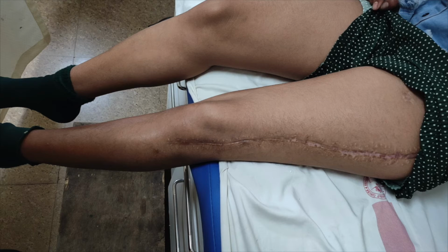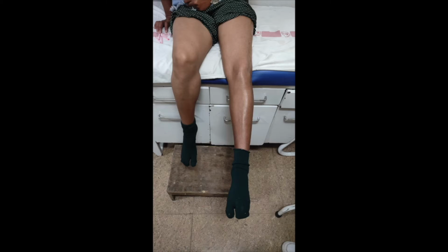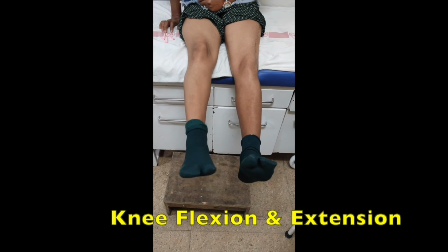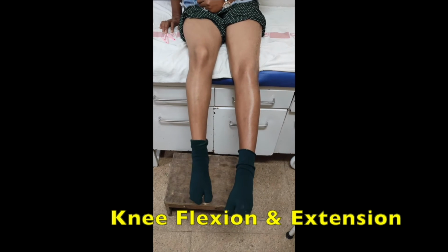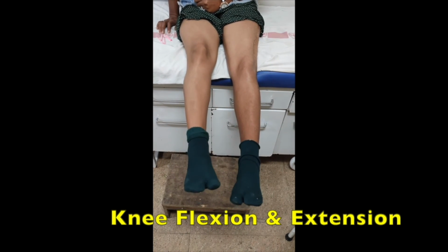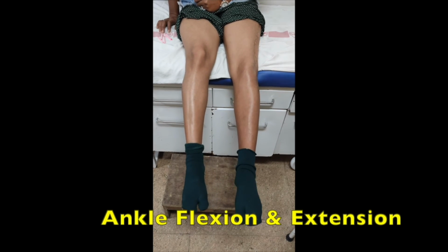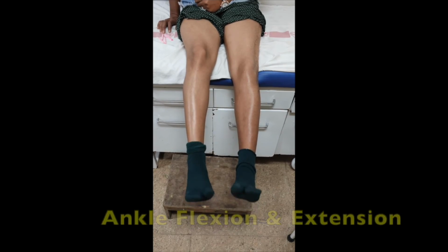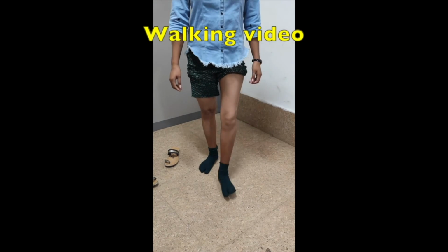The patient is able to stand on one leg and here we can see the knee flexion and extension, and this is the surgical healed scar. Patient had limitation of knee flexion movement. This is the knee flexion and extension at 4 years follow-up after the surgery. Patient is having complete ankle flexion, dorsiflexion and extension as all the nerves were intact.